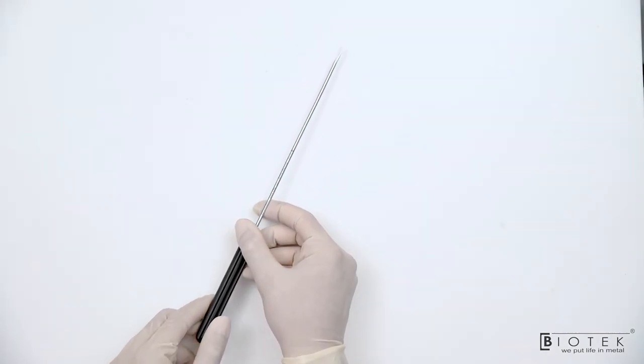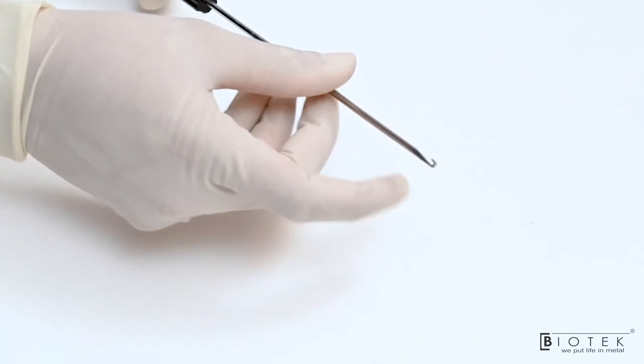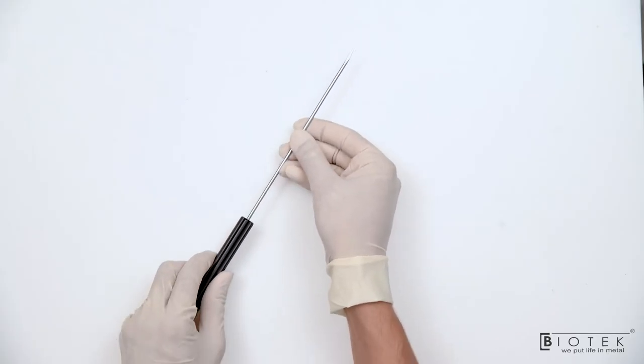This is crochet hook. It has a dual feature. It is used for pulling the suture as well as pushing the sutures.